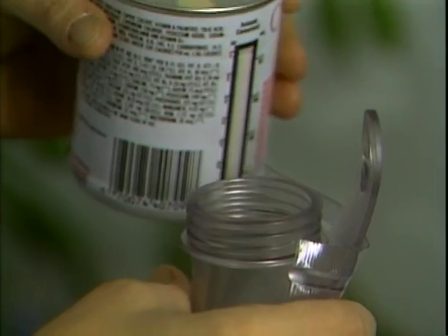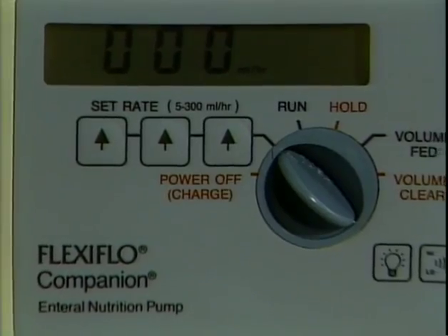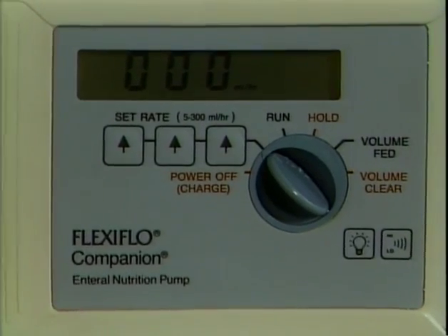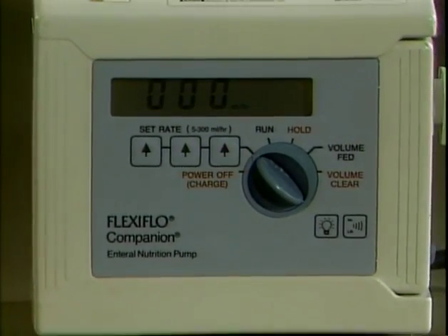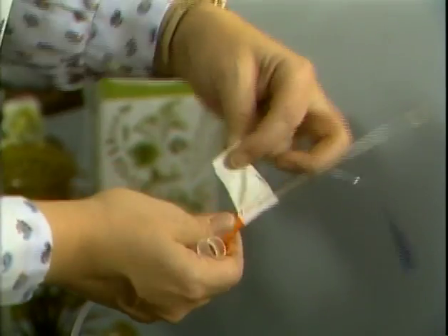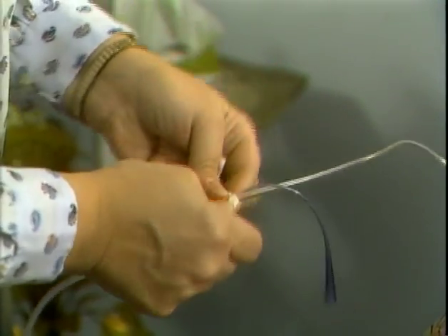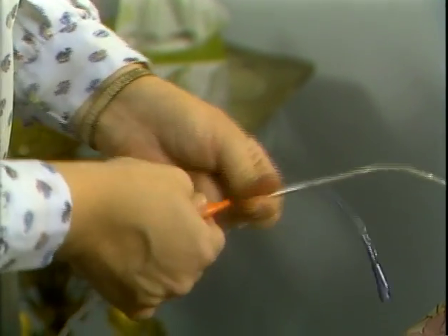Before beginning, Linda washes her hands. She prepares the formula, fills the feeding container with the amount of formula ordered by the physician. Then Linda attaches the tubing to the pump, opens the clamp if there is one, and sets the pump to the appropriate rate. When the feeding is finished, Linda rinses the tubing with water, disconnects the pump from the feeding tube, and clamps the tube until the next feeding. Agnes should not lie flat for at least 1 hour.